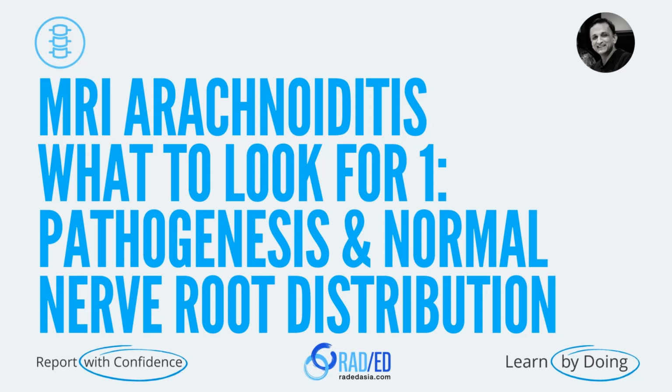This is the first part in a series on the MRI appearance of arachnoiditis. What we're going to be looking at are the various MRI appearances of arachnoiditis, but we're also going to look at the pathogenesis, which is important to know. Arachnoiditis is not that uncommon.